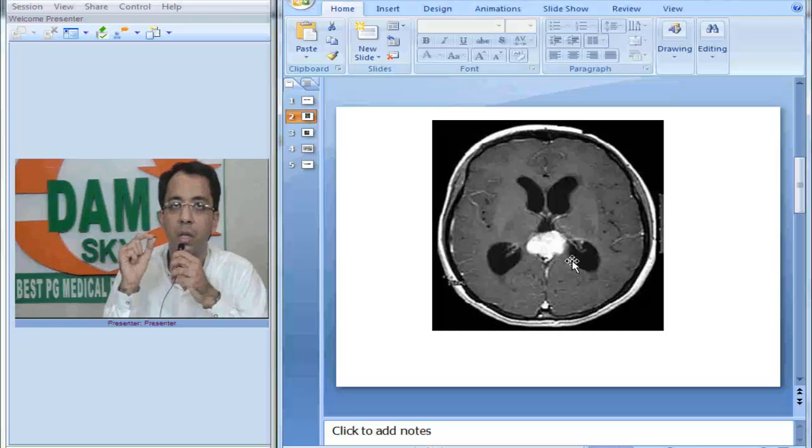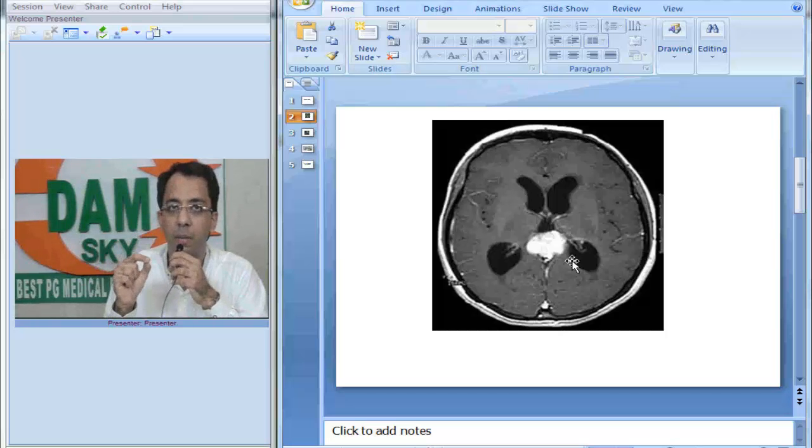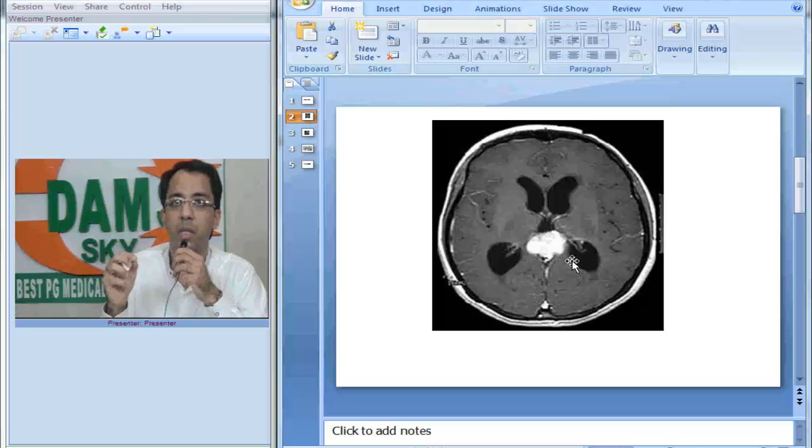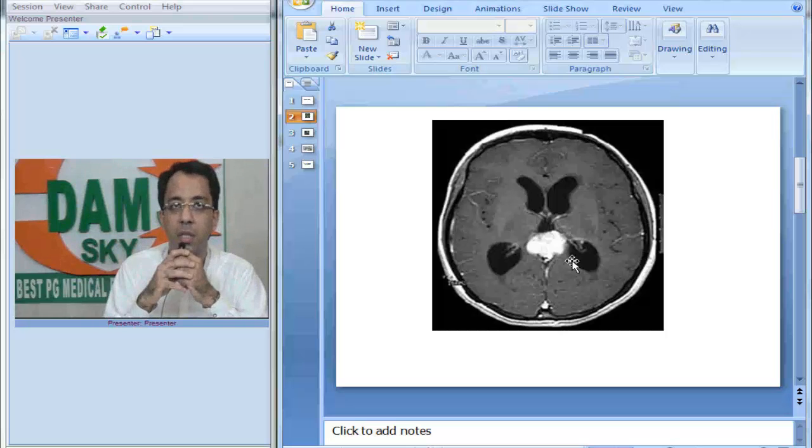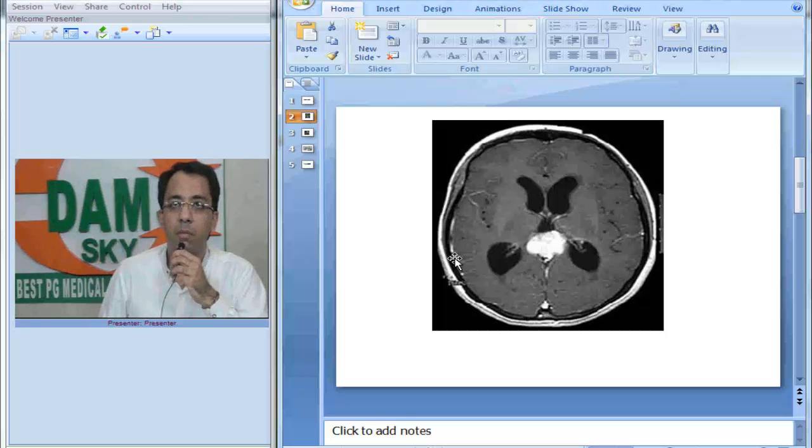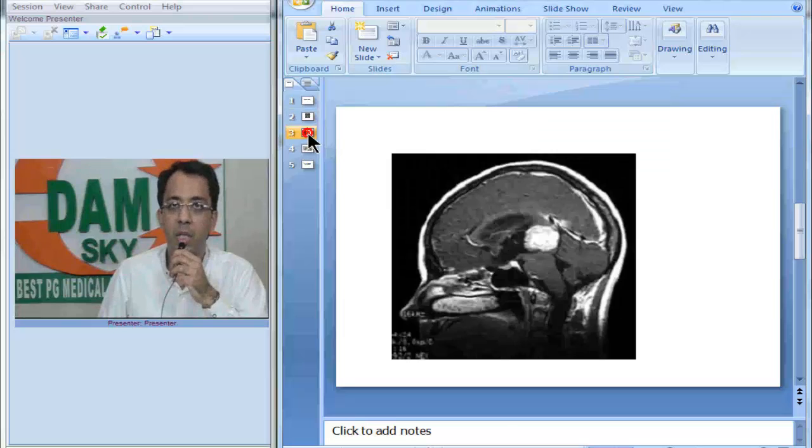We are thinking of a homogeneously enhancing posterior third ventricular mass with obstructive hydrocephalus. We do not see any other pathology in this image and we look at the sagittal image now.